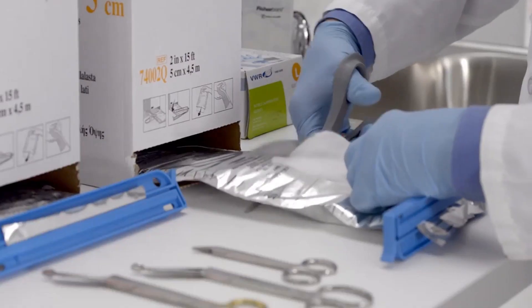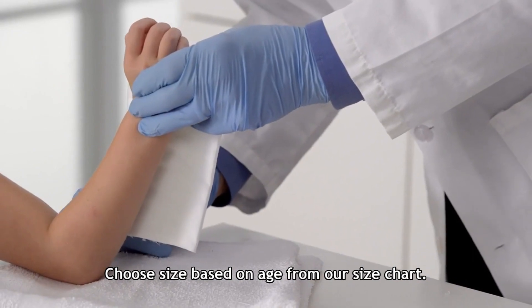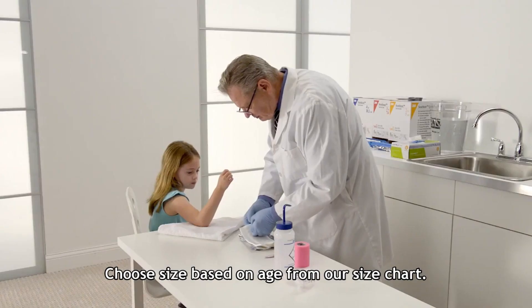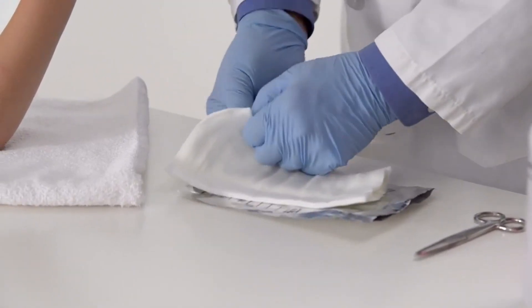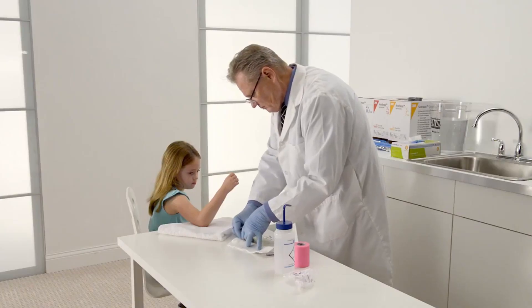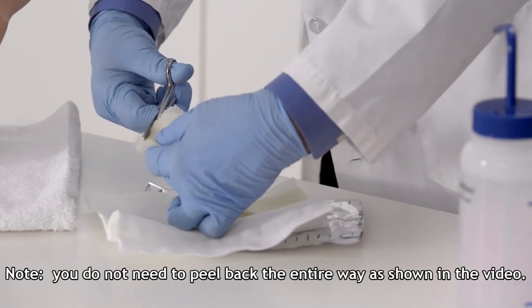Measure and cut the splint so the length measures from the patient's elbow to the distal palmar crease. To protect the patient's skin from the exposed knit fiberglass edge of the splint, open either side of the seam and peel the felt back. Expose the knit fiberglass and trim one quarter inch from either end of the splint.